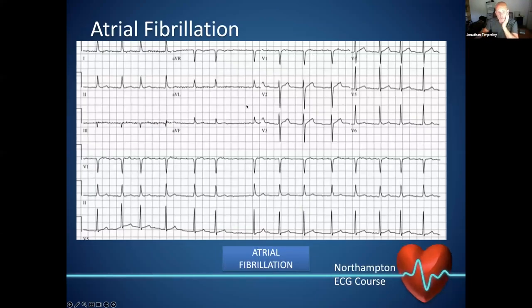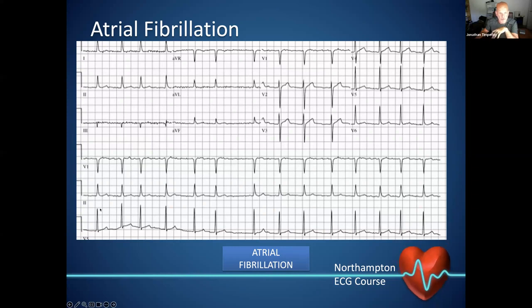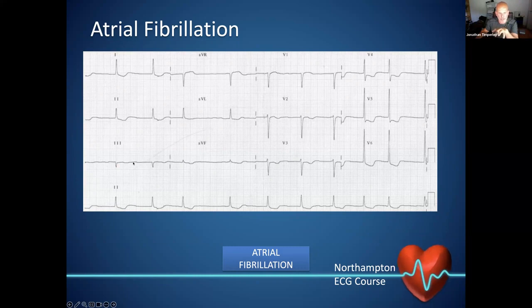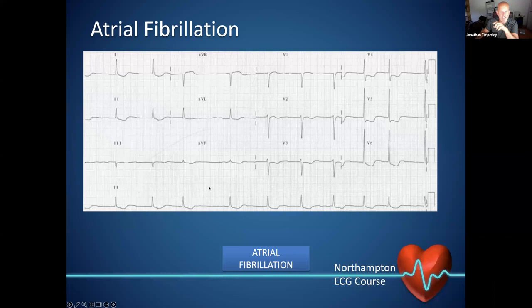With atrial flutter it can sometimes be difficult to identify obvious features, but the key is always to look at the rhythm. If we have a completely irregular rhythm with no regularity at all, even if you can see what looks like organized atrial arrhythmia underlying it — if it is completely irregularly irregular, then it is atrial fibrillation, full stop. Here's a slower example: we have an almost completely flat isoelectric line, but when you look at the rhythm strip it is completely irregularly irregular. There's nothing that says atrial fibrillation at first glance, but the irregularity is what tells you this is AF.